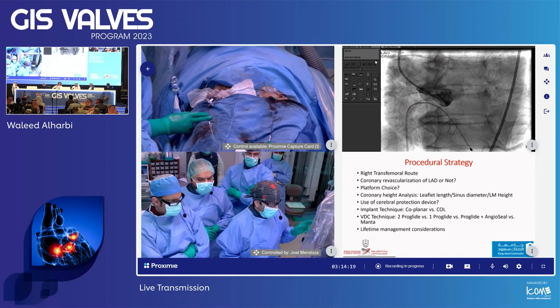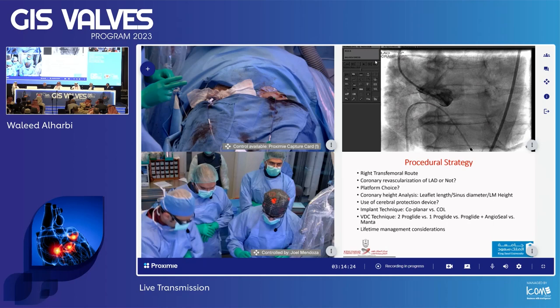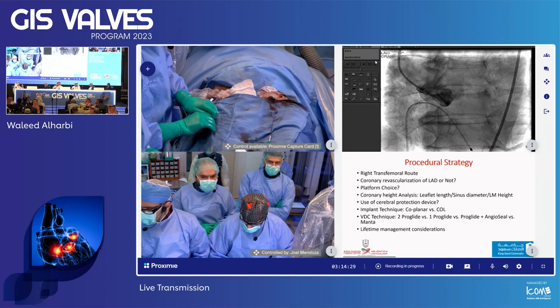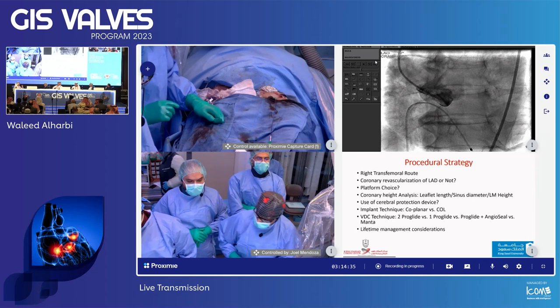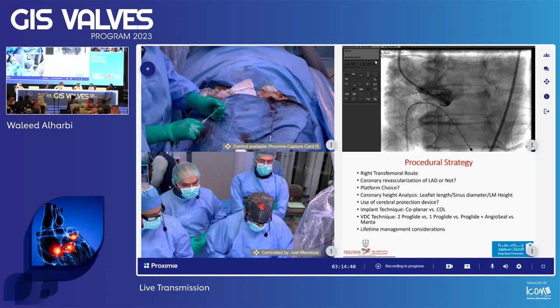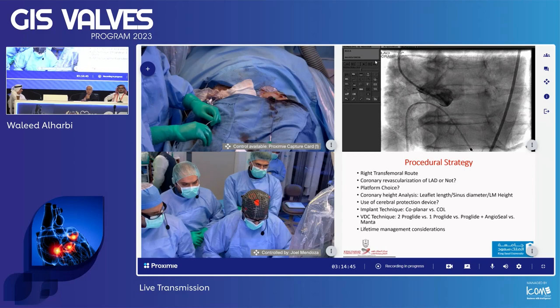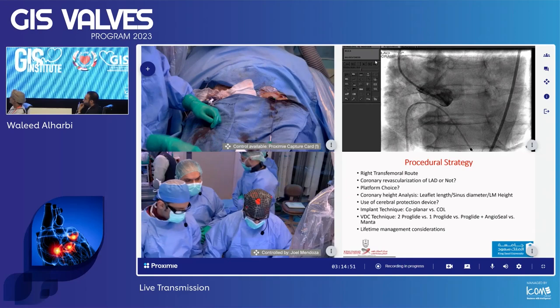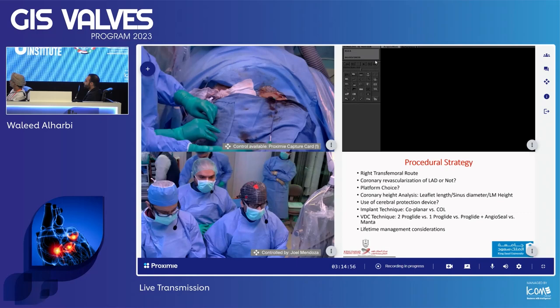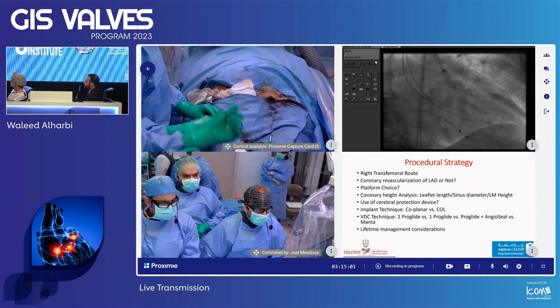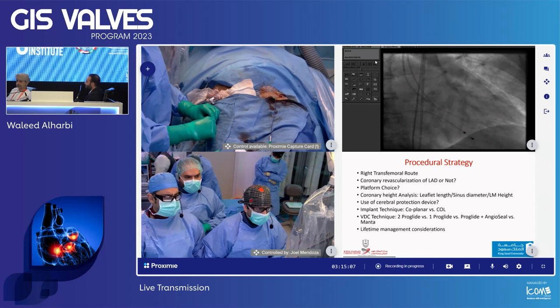Now we'll put in the stiff wire. A question for the panel: would you use LV wire pacing in this situation? I've moved to LV wire pacing in almost every patient for the past few years. The only time I opt for transvenous pacing up front is when I have genuine concerns about high-degree block — if the patient comes in with a broad QRS, or we think the membranous septum is very short with high likelihood of conduction disturbance.